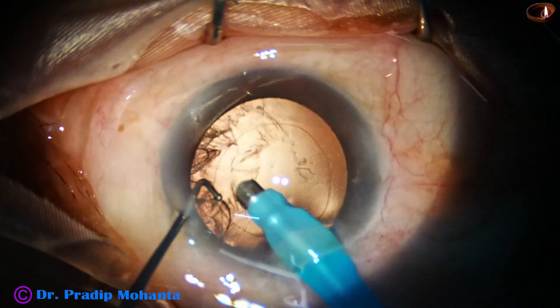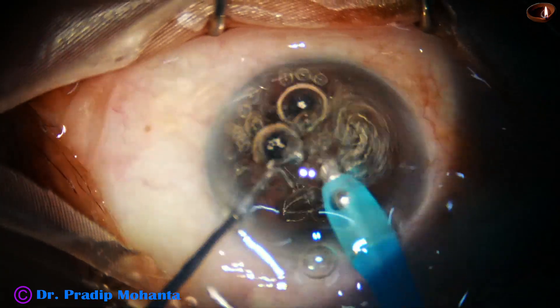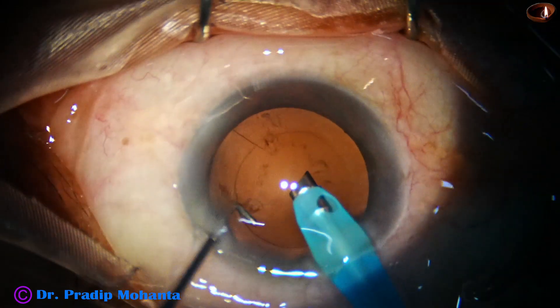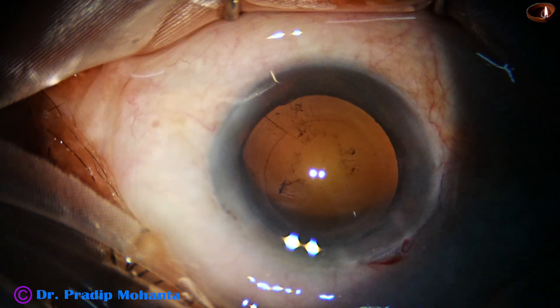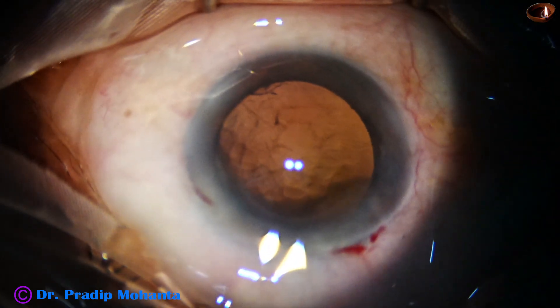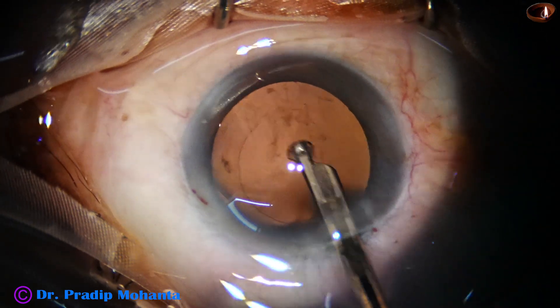By the handpiece itself, I am removing a lot of cortex. At this time, a lot of air bubbles were disturbing this step. A little bit of cortex remains at five o'clock — we don't have to remove all cortex by the handpiece itself. I take the Simco cannula and remove this small speck of cortex.